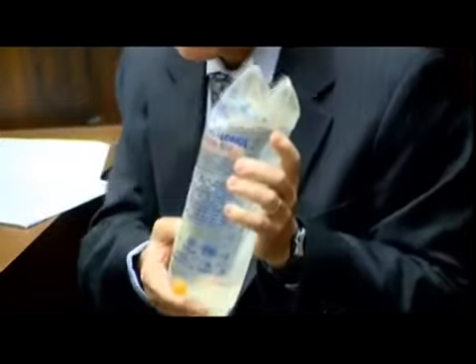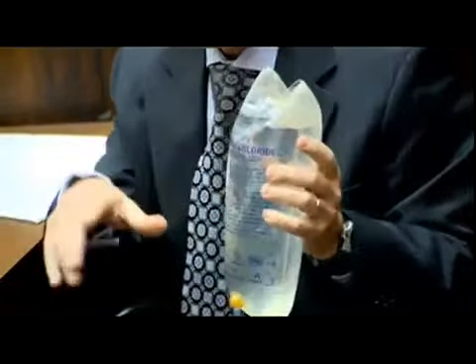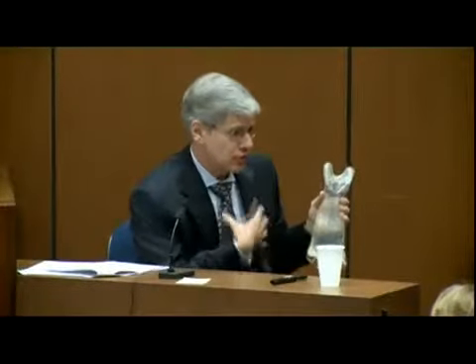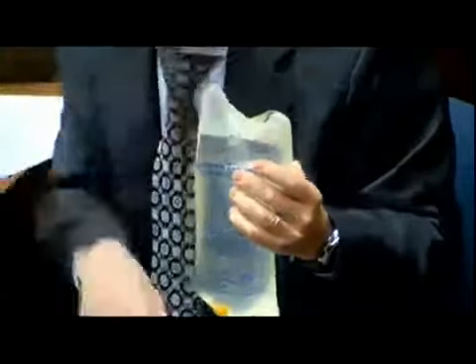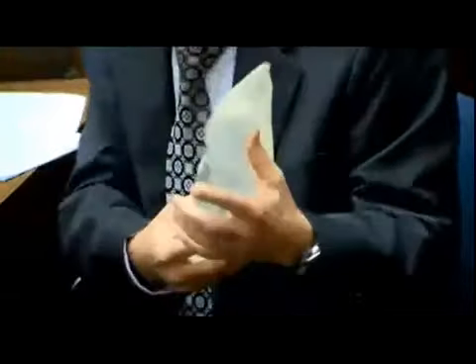This is a bag of saline, salt water. And what it is used for is several things. First, for patients who are a little bit dehydrated, this gives them some fluid. It's intravenous Gatorade, if you will, to help them get an adequate volume of fluid circulating in their blood vessels.